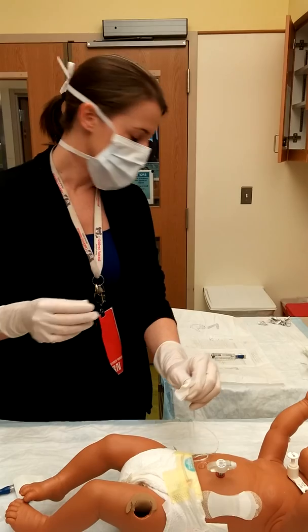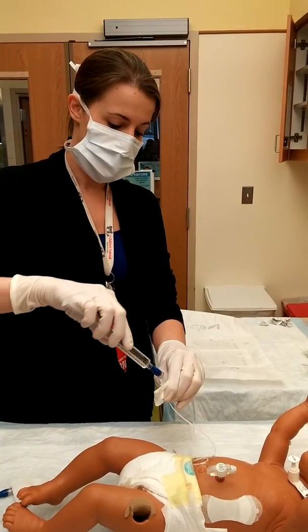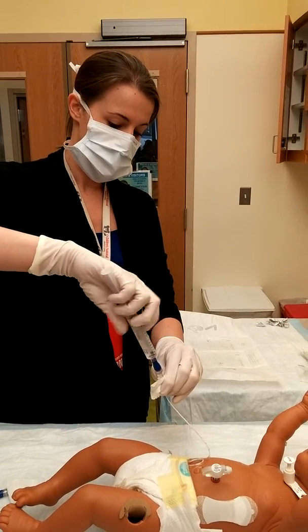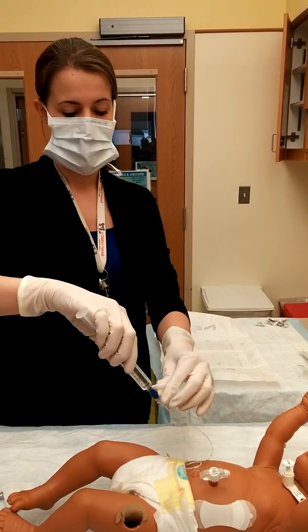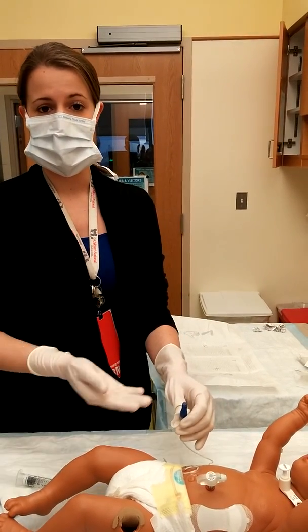After 30 seconds has passed, grab your sterile flush with your new cap, attach, drop some fluid in if you need to, and twist to connect — making sure that it's connected firmly but not too tight. Then you're free to hook up your lines as needed.